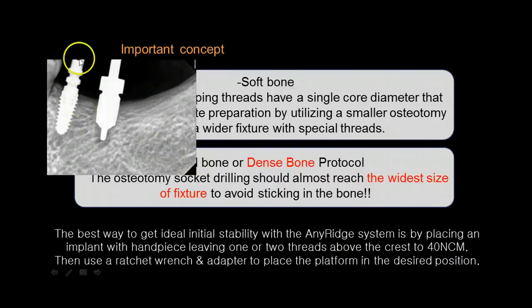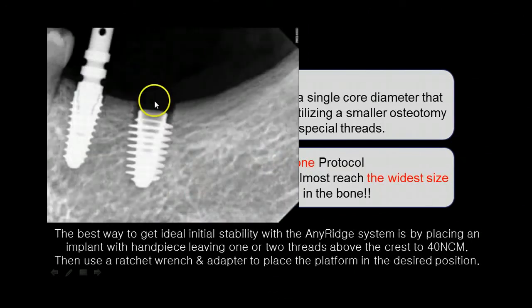Here's a great example. Here's an implant that was placed, and this is, again, courtesy of Dr. Daryl Berg. This doc actually had dense bone at the top, so he just went ahead and got the 4.8 stopper drill and used it similar to a cortical bone drill. Okay? And then he placed his implant. This is a 5.0 by 11.5 implant, but look at the crest here.